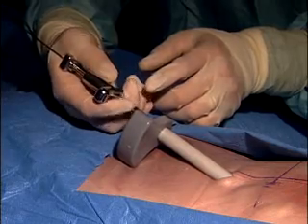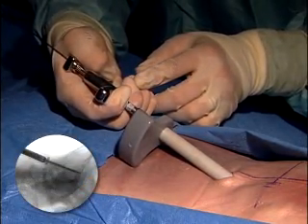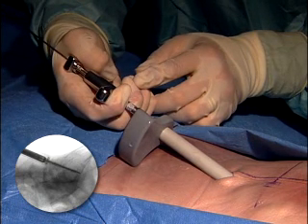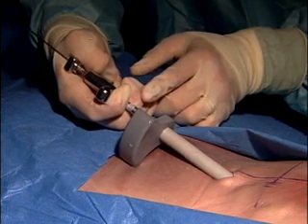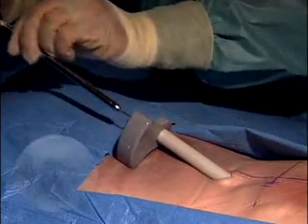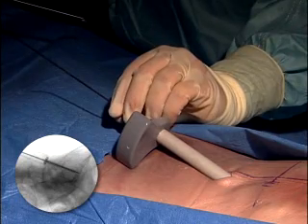Using only one hand to compress, the surgeon can tell when the implant is properly positioned under fluoro by watching the self-retaining washer tilt and lay flat against the bone, indicating that the device is inserted all the way. Once the surgeon is satisfied with the compression, release the handle and pull straight back on the compression tool while paying close attention to maintain wire placement.